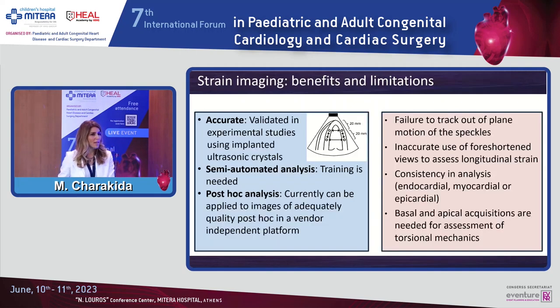Now, we believe that strain analysis is accurate with speckle tracking. The reason for that is that we have experimental studies using implanted ultrasonic crystals that demonstrate that the measurements that we obtain are accurate. The fact that we have semi-automated software for analysis is a great benefit. We need less and less training nowadays, and we can use any ultrasound machines, now with vendor independent platforms. But we need to be careful not to rely completely on the automated analysis.